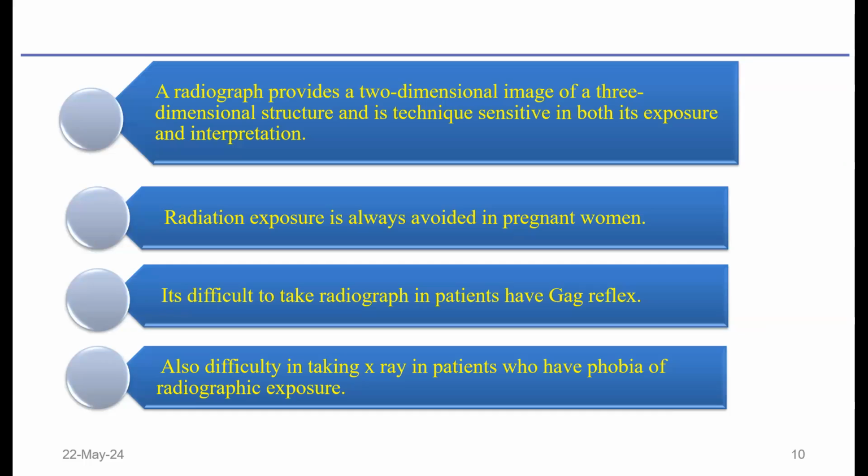It is also difficult to take X-rays in patients who have a phobia of radiographic exposure. There are patients who are overconcerned. Even though dental X-rays have very minimal exposure compared to conventional medical X-ray systems, there are certain patients who are very conscious about taking a lot of X-rays, because every root canal treatment might require a pre-op X-ray, a working length X-ray, a master cone X-ray, and a post-obturation X-ray. 4 to 5 X-rays are needed. So it becomes a little cumbersome for the doctor as well as the patient to accept that we should take more radiographs in the same patient. In such cases, an electronic apex locator will be more handy.